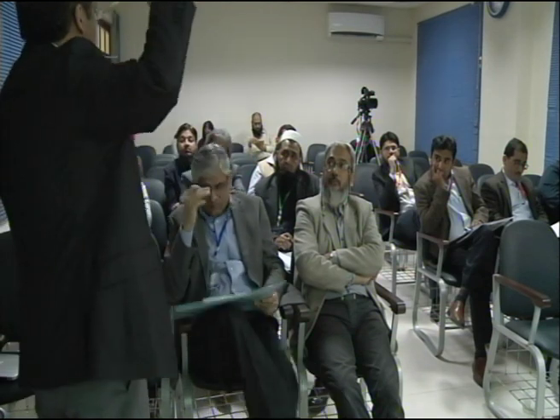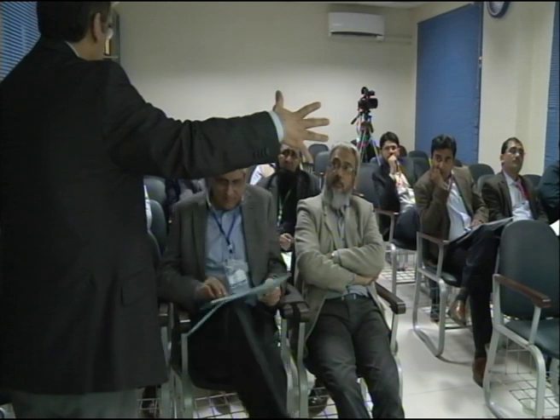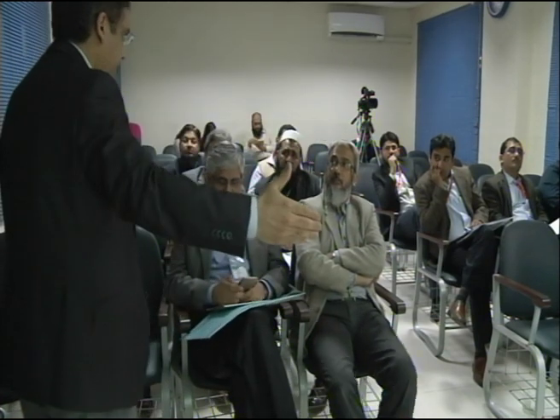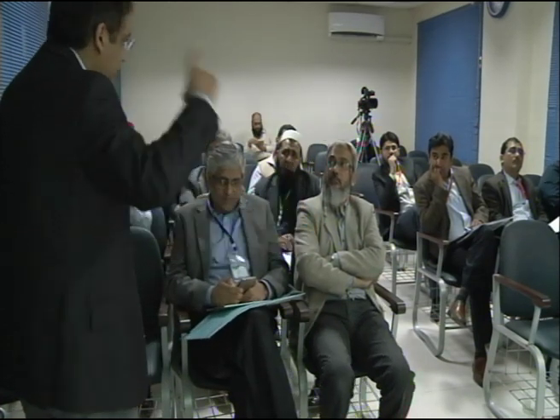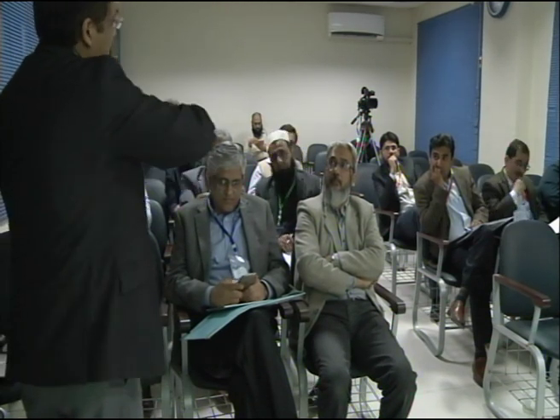Okay, it's a man, 60 years old, pancreatic cancer, forget about post-ERCP pancreatitis. They almost never get it. So don't be like this is the first thing, is the patient factor.